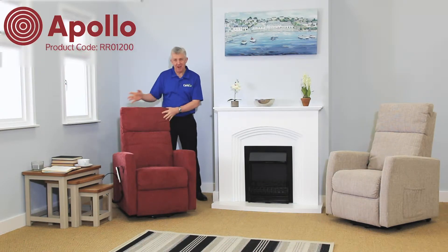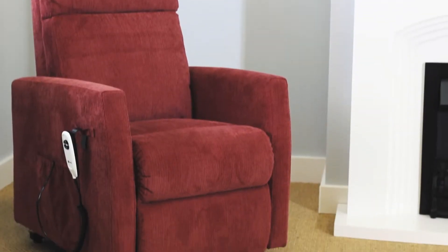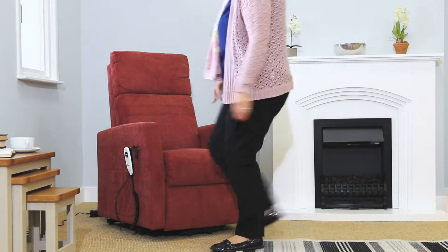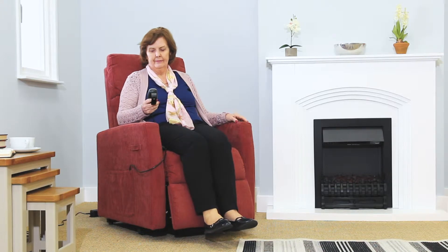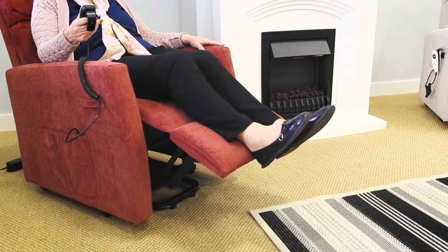This is the Apollo, part of the Maxi Comfort range of riser recliners from Careco. The Apollo riser recliner's stylish and confident design combines state-of-the-art components with safety and comfort. Its built-in single motor means you can adjust the footrest and the backrest to the position you find most comfortable, offering a level of customisable comfort not found in normal armchairs.